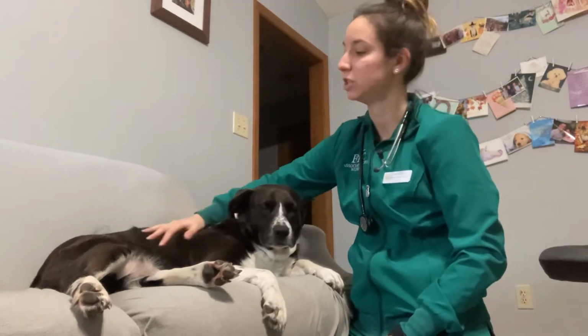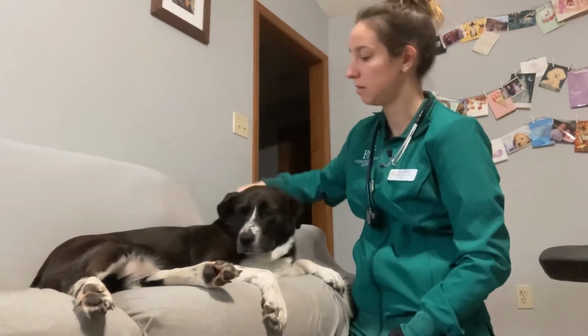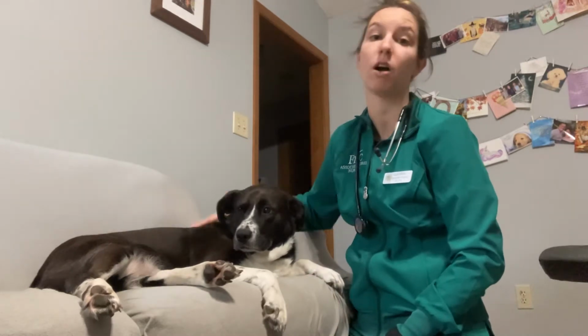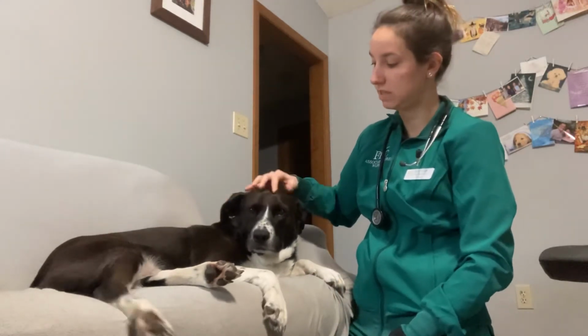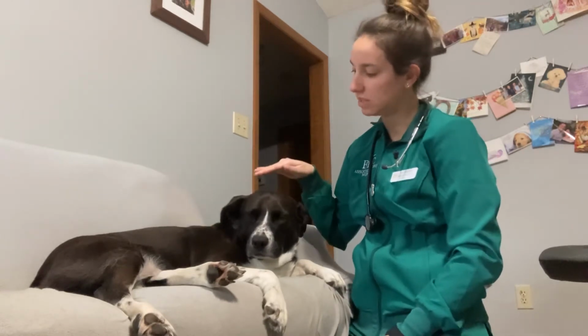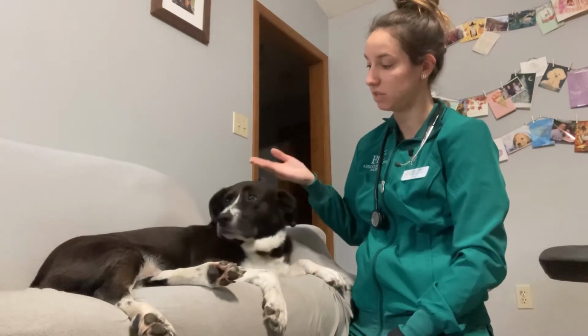Normal adult respirations run between 12 and 20. Sadie's respirations are currently going to be a little bit closer to about 30, which is normal for a dog, especially a dog of her size, and given that she is lying down and resting. If I needed the assistance, I am watching the side of her, and it's actually really easy while she's in this position to see chest rise.